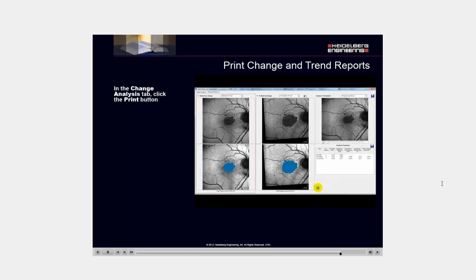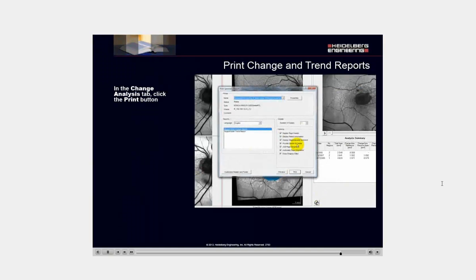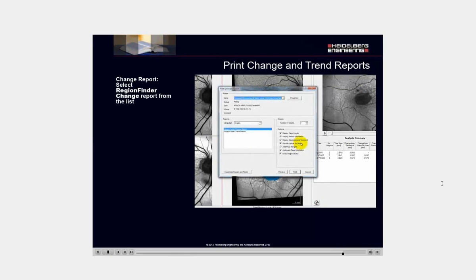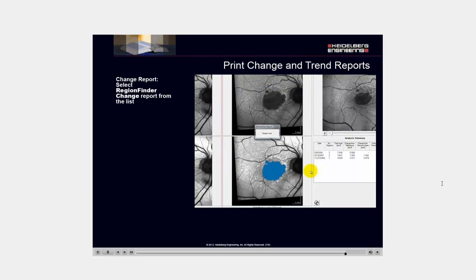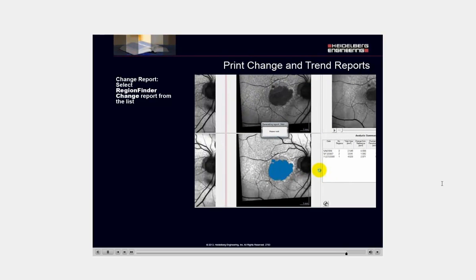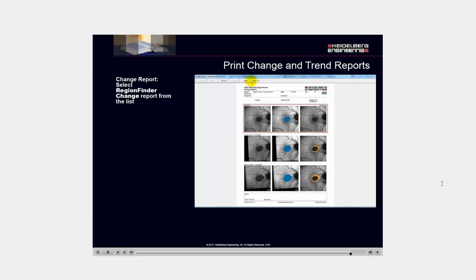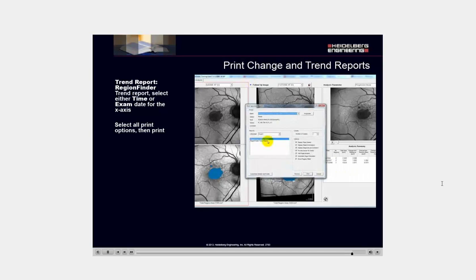In the change analysis tab, click the print button. The print Spectralis report dialog box will open. For a change report, select region finder change report from the list. For a trend report, select region finder trend report and either time or exam date for the x-axis. For either, select all print options and then print.